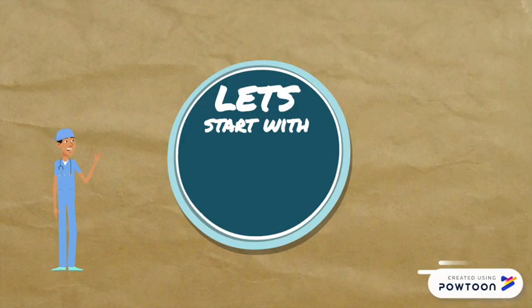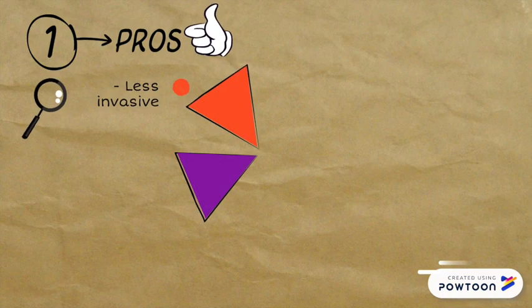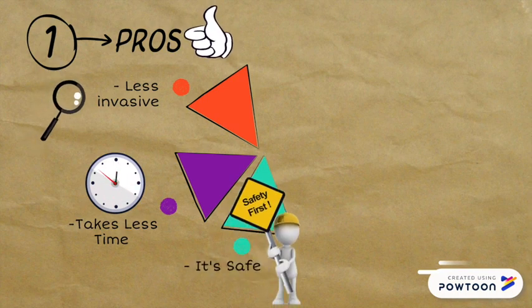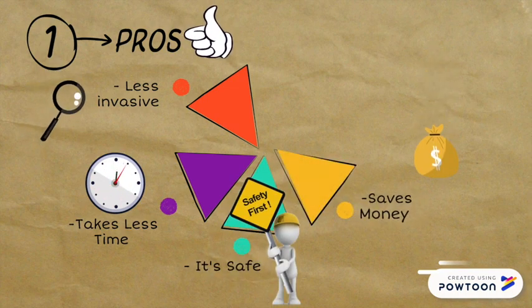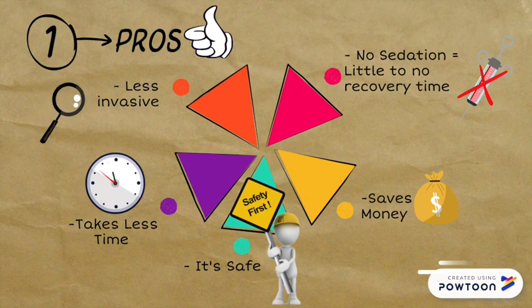Let's start with the pros. Firstly, despite having to insert a tube into the rectum, virtual colonoscopy still provides a less invasive process compared to regular colonoscopy. The procedure takes less time, roughly 10 minutes. It's safe, more affordable, and doesn't require sedation, resulting in little to no recovery time.